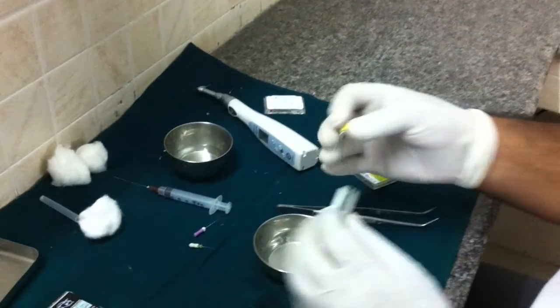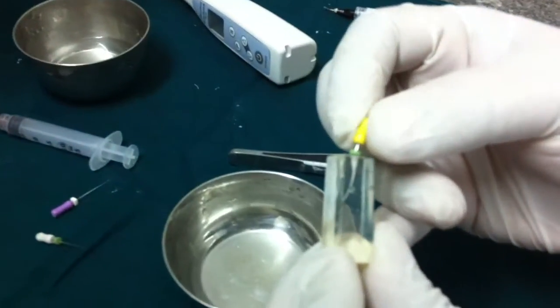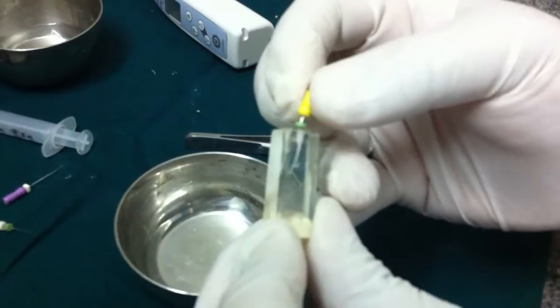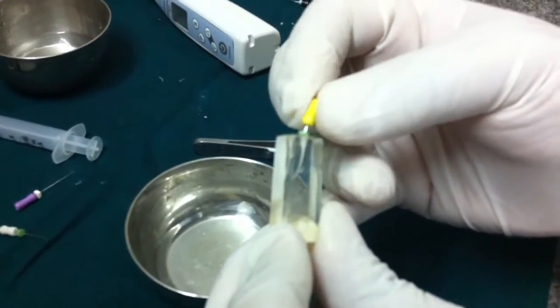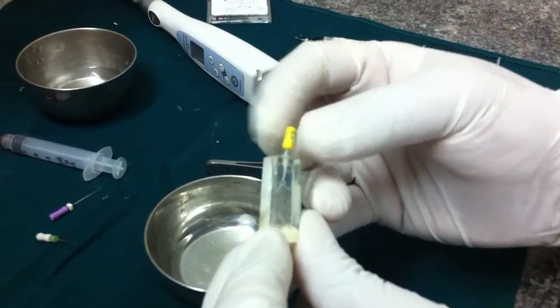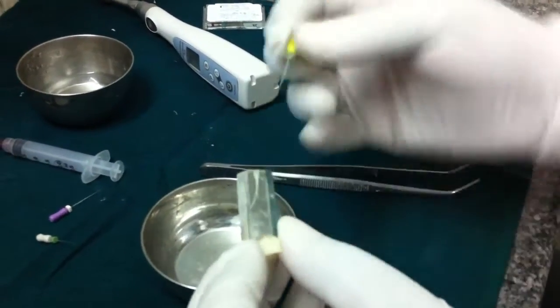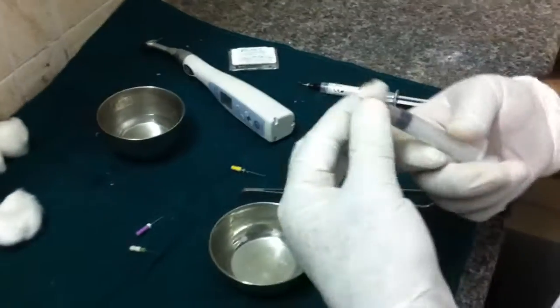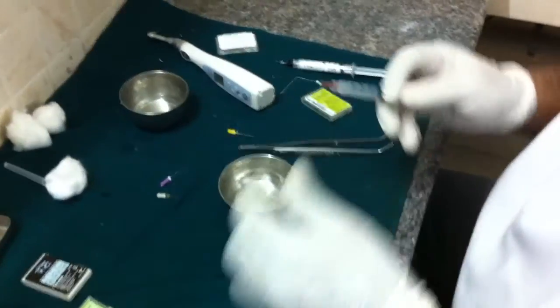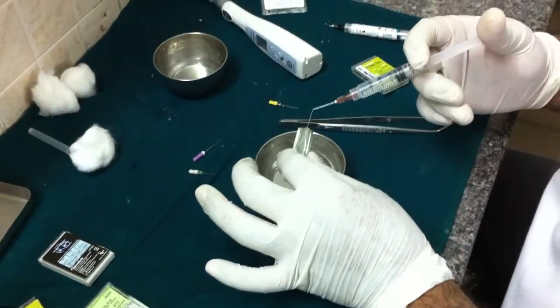EDTA followed by watch winding up to the entire working length. Irrigate with saline.